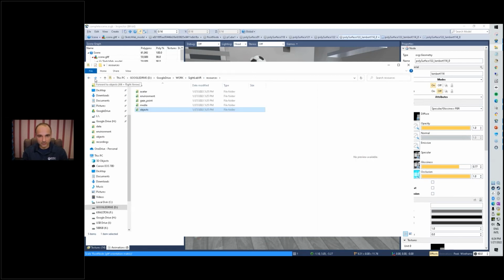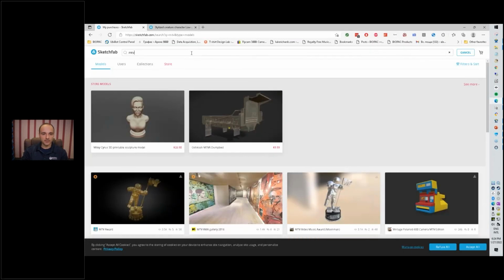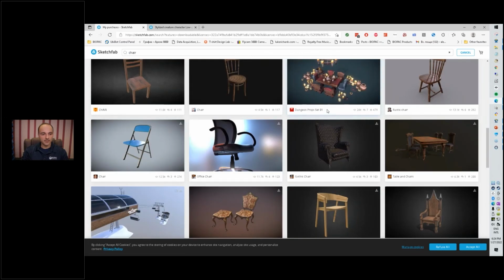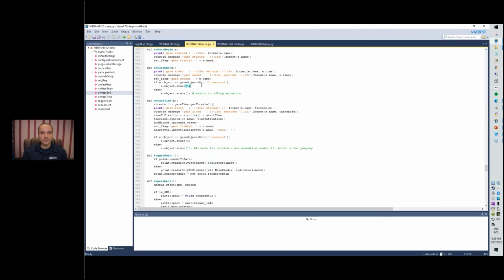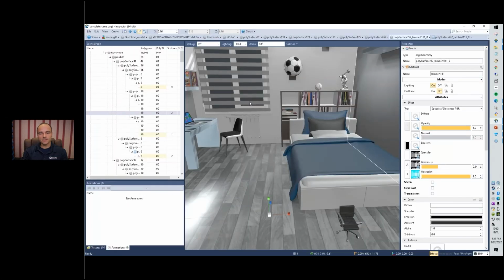The reality is everybody's just downloading things from the internet these days, because let's just have a look here. Let's look for chair and downloadable models of chairs. There are so many chairs. A bunch of them are free, some of them are paid, but there's a lot of objects out there that you can just use. Basically that's how it works. You can just use it as is. You can get 3D models and just perform an eye tracking experiment.